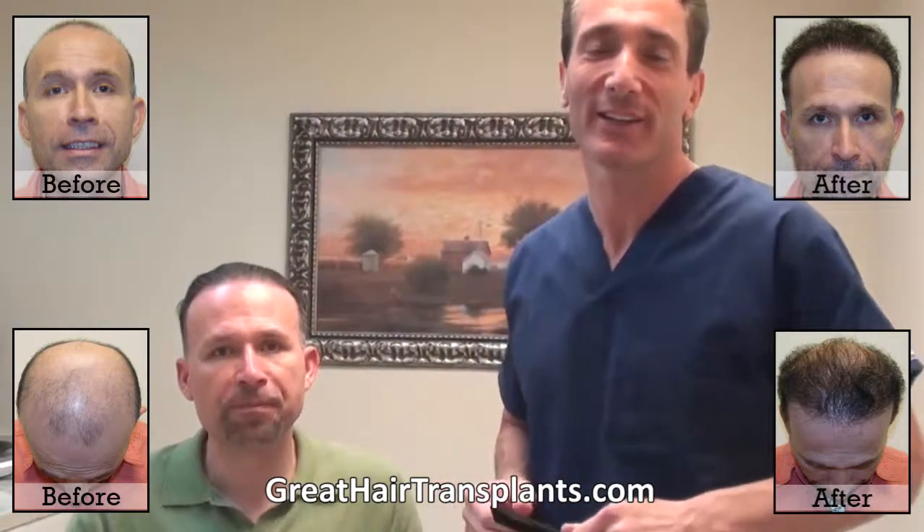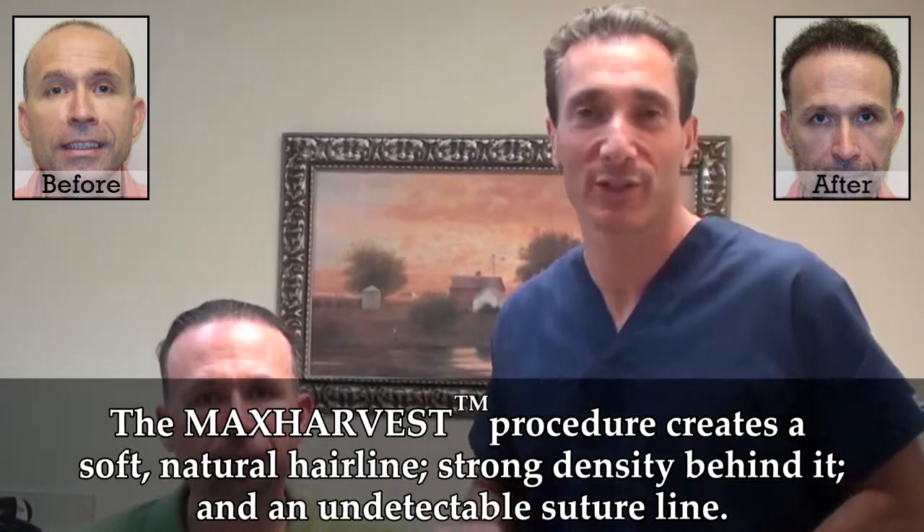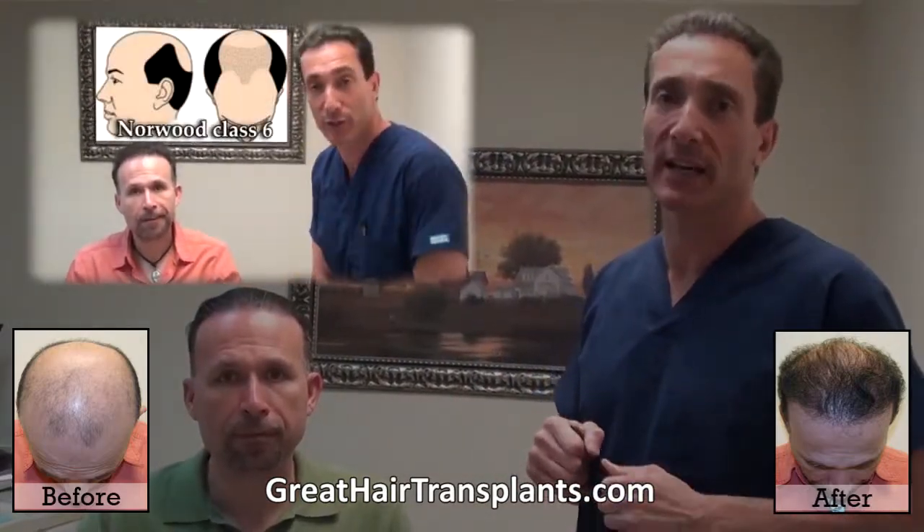Hi there, here we are with our patient Marius. Marius had two MaxHarvest hair transplant procedures with us. Marius was what's called a Norwood class 6.